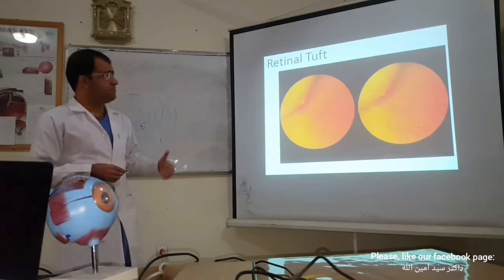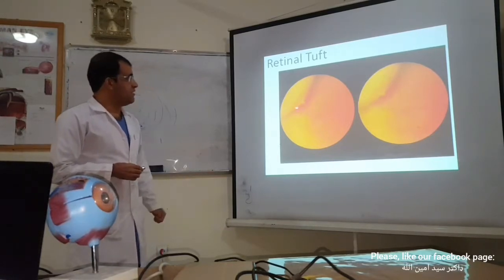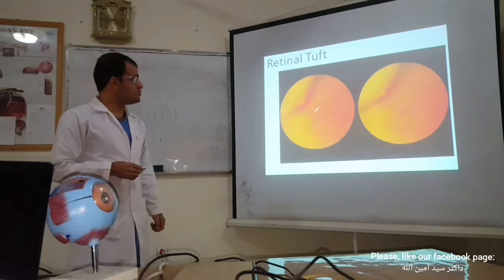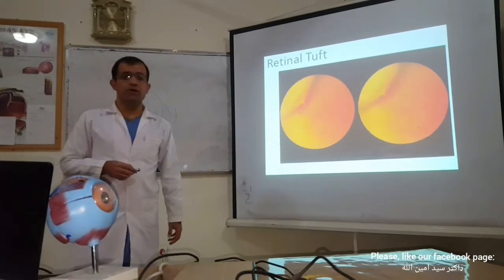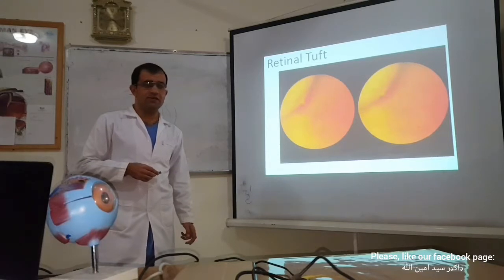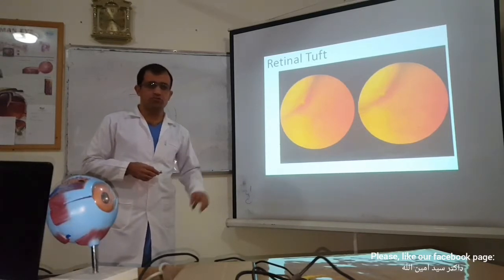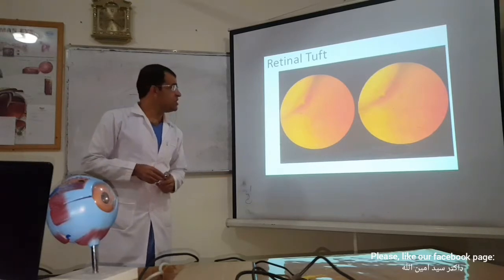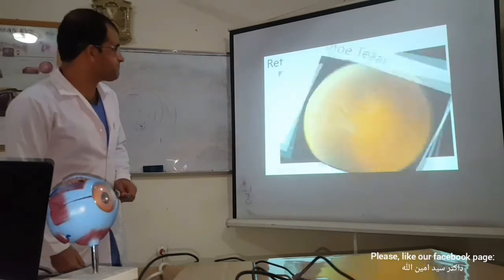And in the books or in the texts, they talk about retinal funduscopy. They will say the tufts should be colored by blue. And then you must know what is the tuft. The elevation of the retinal tissue, sometimes by traction and sometimes without traction, they are called the tufts. And we color them by blue.